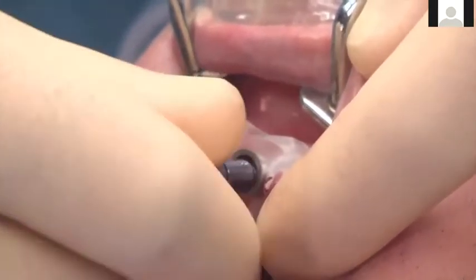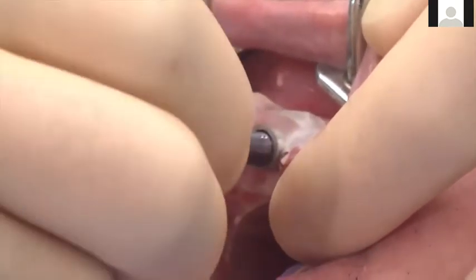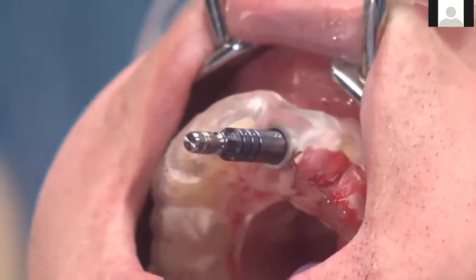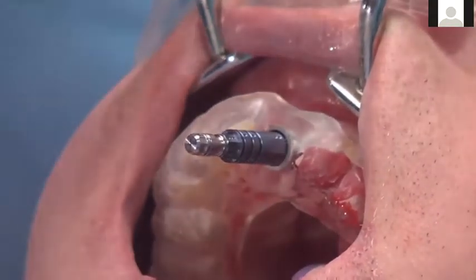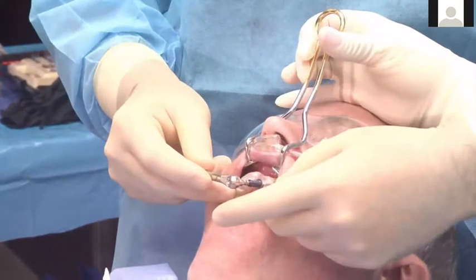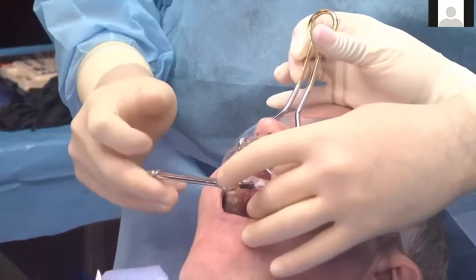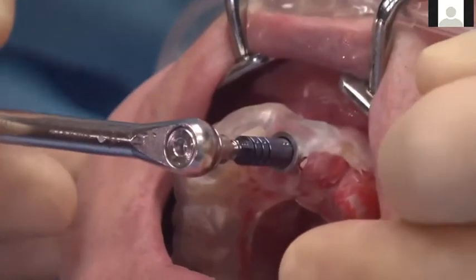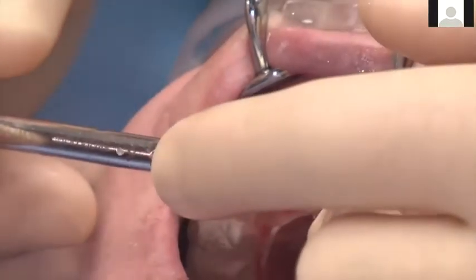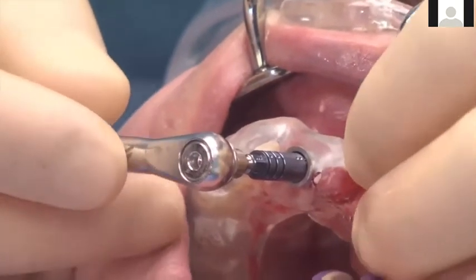You don't need to do this anymore really, because now Straumann has come out with a guided mount that fits really well. So you can still use the lock-in mount and use the guided mount driver, and that works extremely well. That was not available when we did this specific surgery. So here you can see this is the guided mount, and now we just simply put the driver on it. And I usually like to use the hand ratchet and not necessarily use the motor driver. A lot of people like to use the handpiece driver. That's totally fine. That's totally preference. My preference is just to use the hand ratchet. I feel like I have a little bit more control doing it that way.